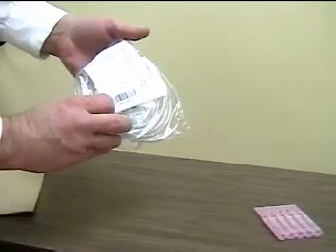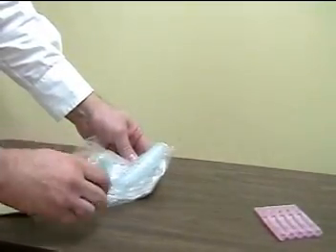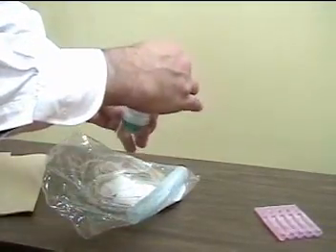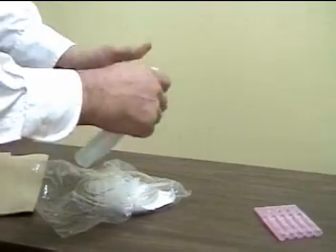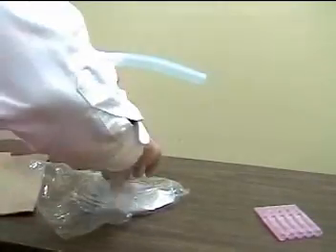SVN usually comes in a prepackaged container. It's not very difficult to assemble. Inside the package is the nebulizer, a T which often fits on the top of the nebulizer, and the 6-inch reservoir tubing which connects to one end of the nebulizer.